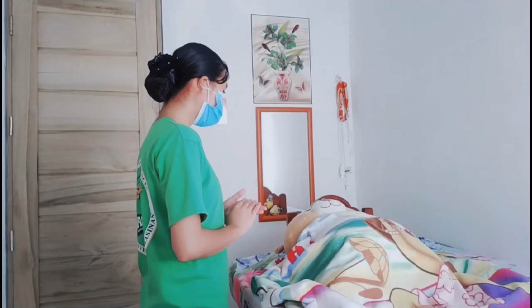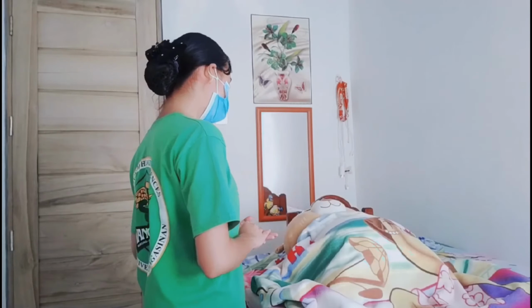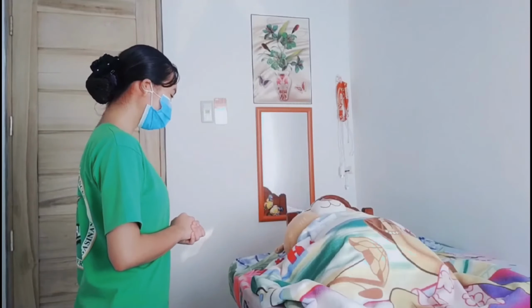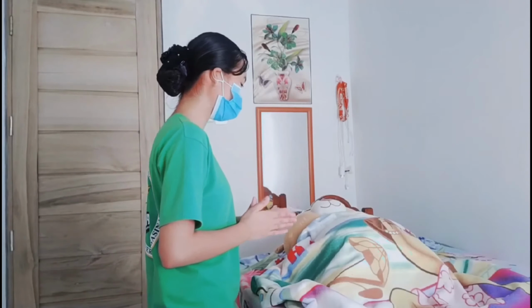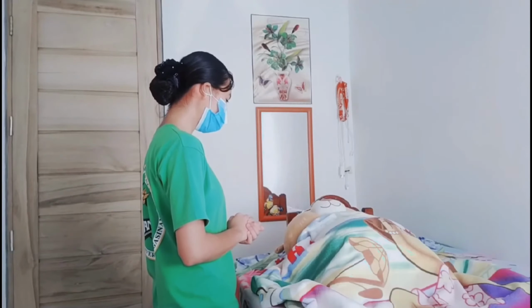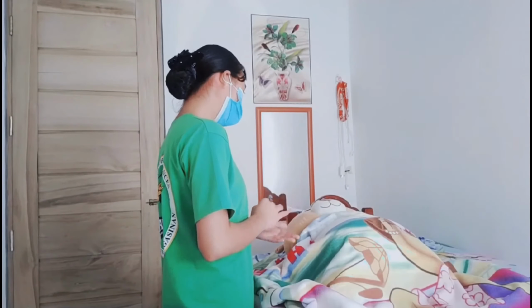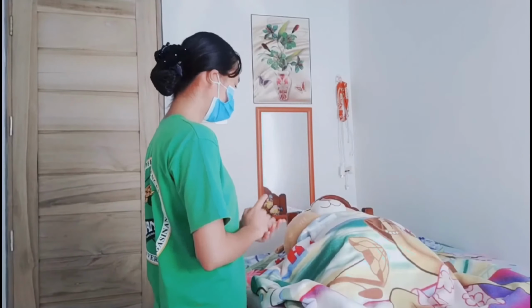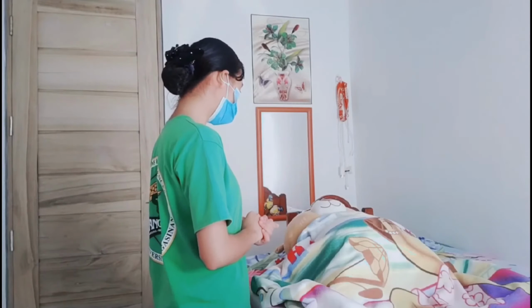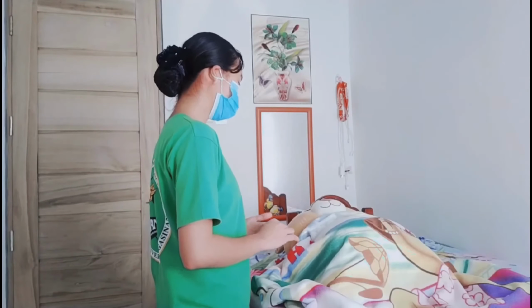Good morning, ma'am. I am Angelica, your student nurse for today. How are you feeling? That's good to know. Ma'am, can you state your name and birthday for me, please? Thank you, ma'am. According to the doctor, I'm going to insert a catheter into your bladder to drain your urine. Is that okay? Ma'am, are you allergic to iodine or shellfish? Are you allergic to latex? That's great. Ma'am, just relax, okay? Thank you, ma'am. Do you have any other questions before we start the procedure? No? Okay, thank you, ma'am.